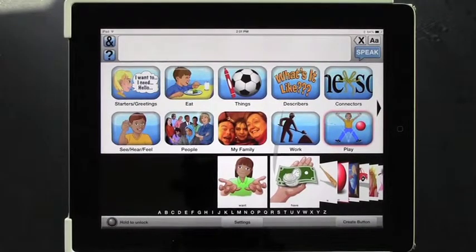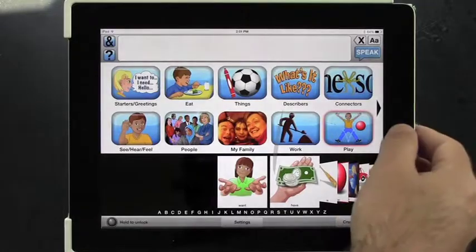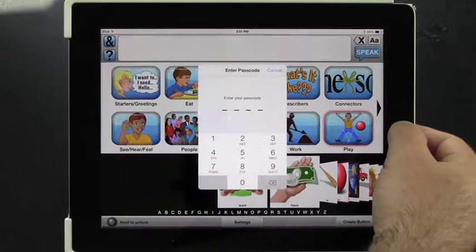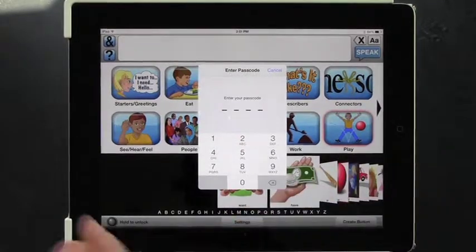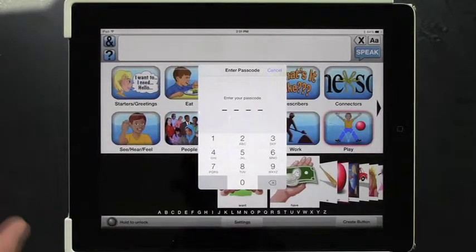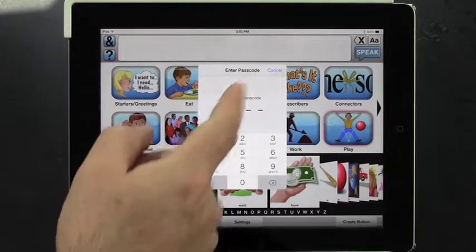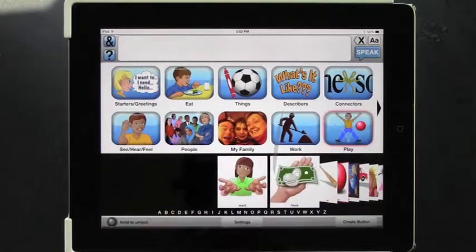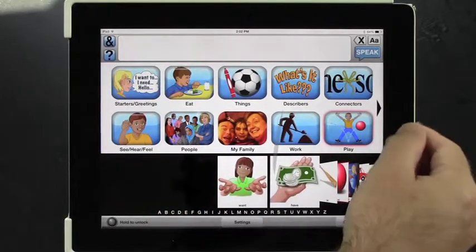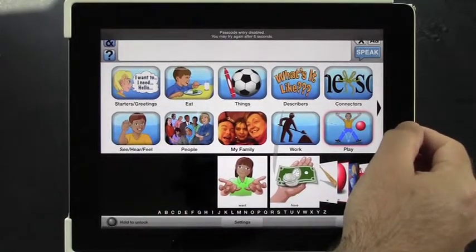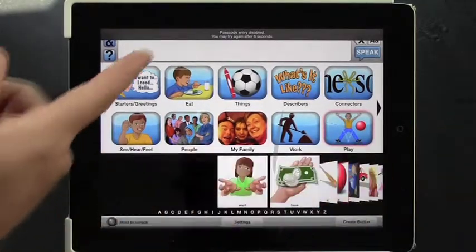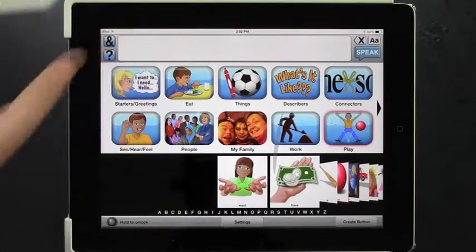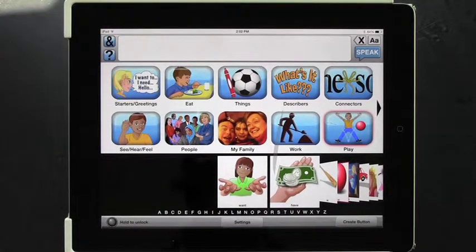So what if they like to hit the home key really fast? Triple click on the home key: one, two, three. It asks for the passcode. If you don't enter the passcode right away and you try to do it again — one, two, three — it says passcode entry disabled. You have to wait a few seconds before you can try it again.